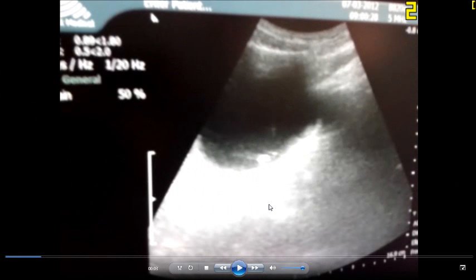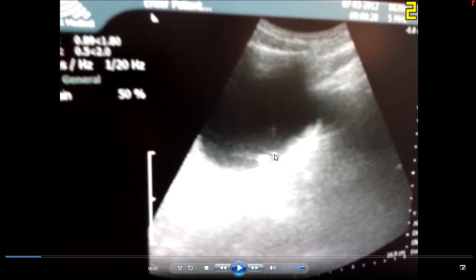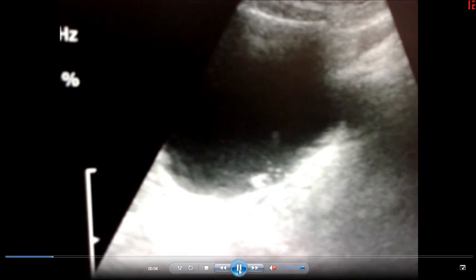Hi friends, this is a video of ultrasonography of the bladder. This is your bladder, and in this video you can see multiple small stones in the bladder, which were formed due to bladder obstruction in a patient with benign prostatic hyperplasia. You can see these are multiple stones which move when the patient moves.